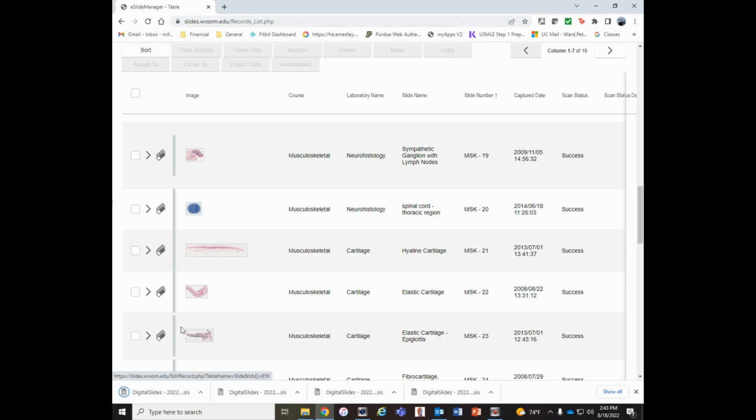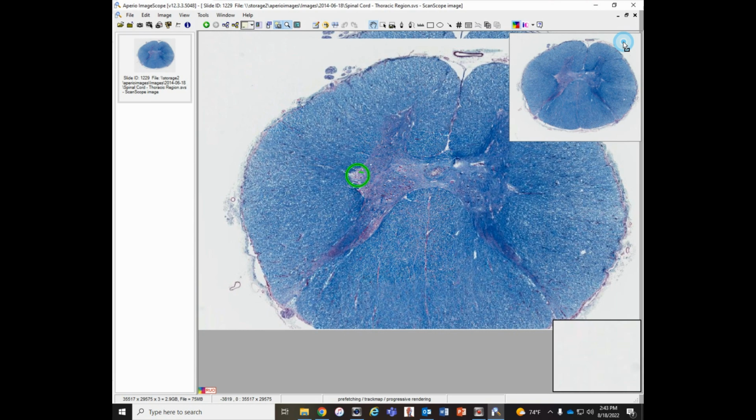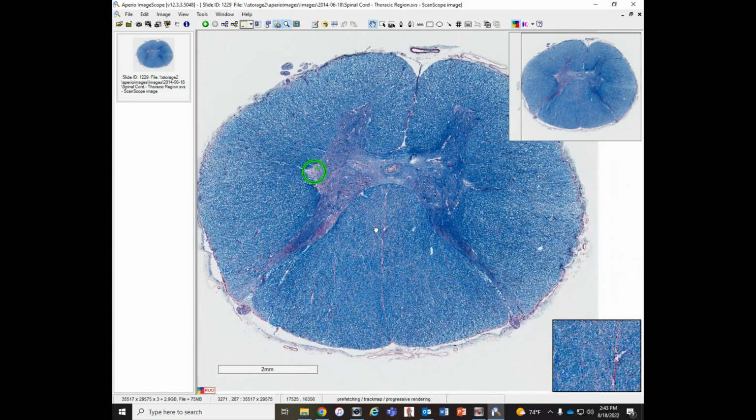We're now going to switch gears just a little bit and take a look at the spinal cord and some of the features that are there that are similar to what we've seen before, but have their own little twists. First off, one thing you might note is that the spinal cord is upside down compared to the way that you usually look at it in books. So we've got the posterior side here, anterior side here. The anterior ventral horns are here and the posterior horns are here.